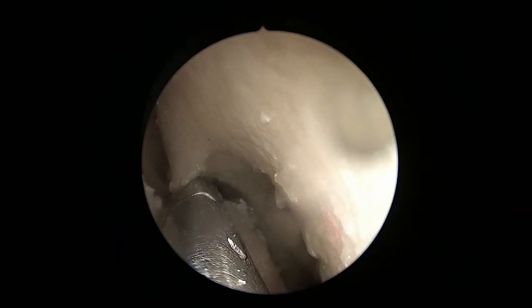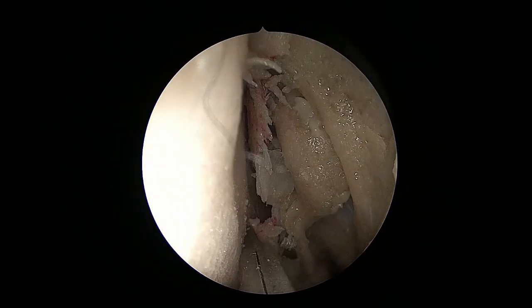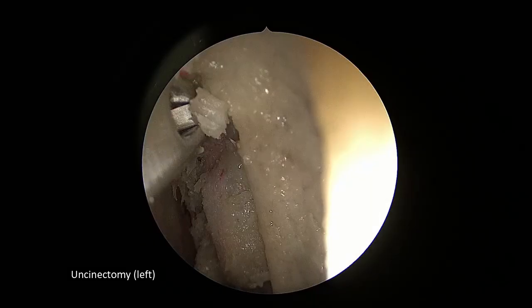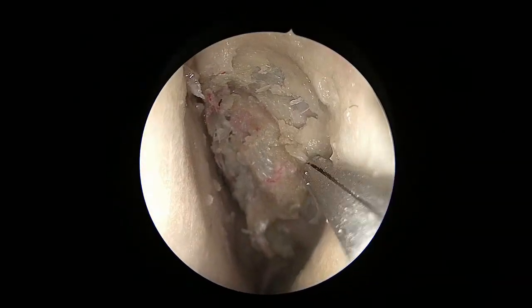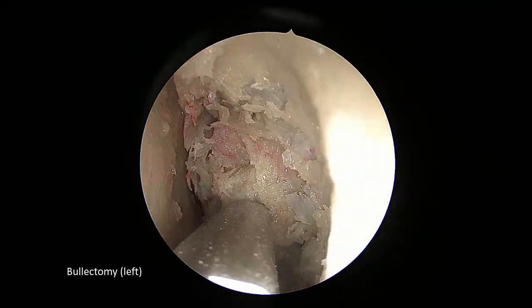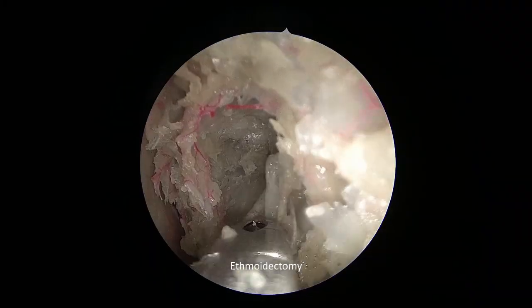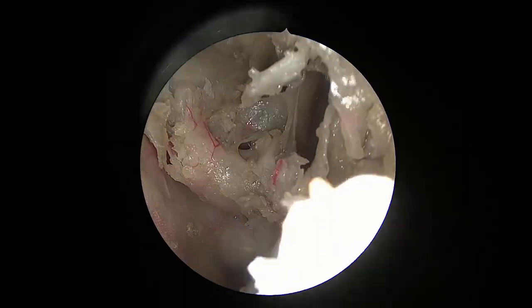Now we're going to turn our attention to the middle turbinectomy on the left. The middle turbinate is resected here using a through-cut. This is followed by uncinectomy and removal of the bulla ethmoidalis. This process completes the medial maxillectomy and anterior and posterior ethmoidectomies.